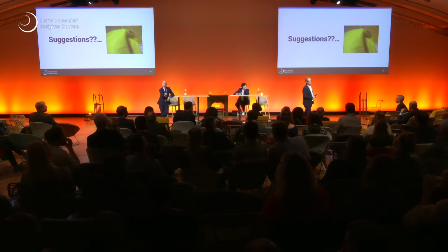Impossible access. Peter, why was it impossible? It was because of the angle of the left common. So the sheath in that configuration was not stable, and we couldn't reach the lesion.